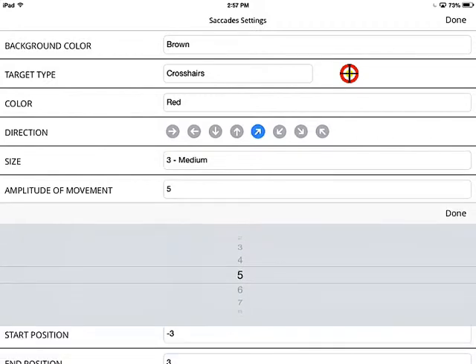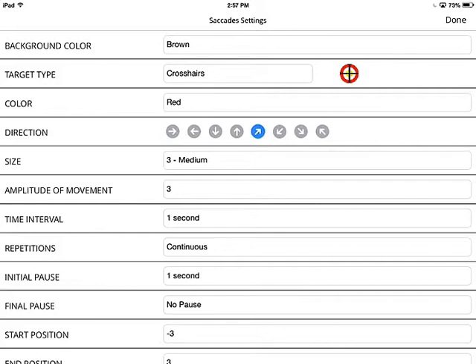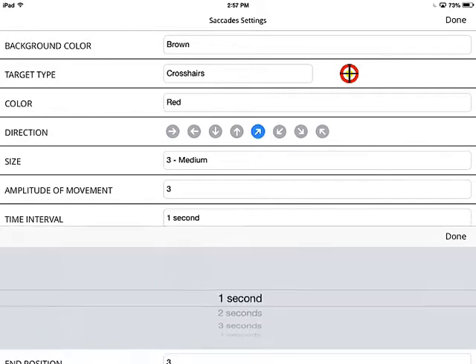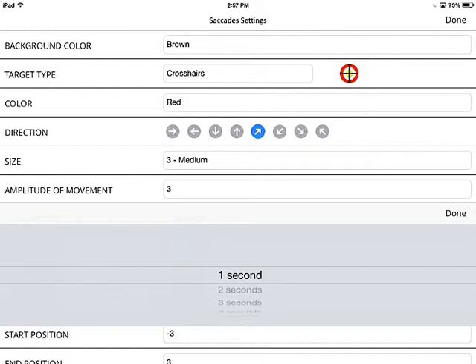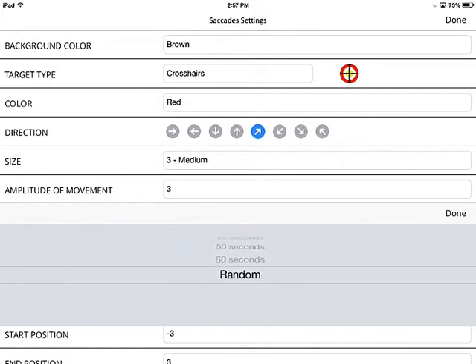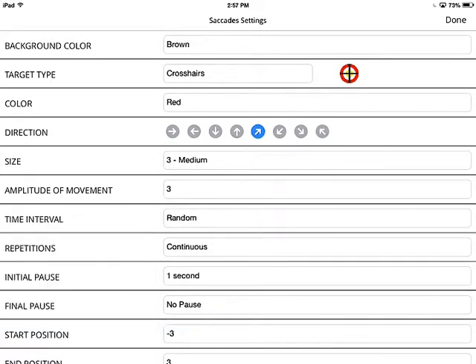Amplitude of movement means how many movements will occur between your start and end position. If you want just one saccade, you select one — but let's select three. The interval time is how much time there will be before the next saccade. Let's leave that at one second — you have options all the way up to 60. Then there's a random option, so each hold time will be different and randomized — let's go ahead and pick random.